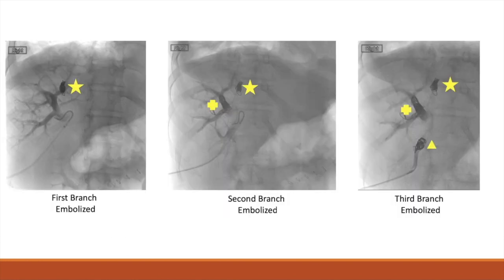After stasis is achieved and the pigtail catheter has been used to perform a portal venogram, we swap it out for an appropriate catheter in order to embolize the accessed portal vein, which will be the final target branch. Since access was achieved through a vein that needs to be embolized, the catheter is withdrawn distally to the point of interest and embolization is performed. The triangle marks the final point of embolization as we pull out of the portal system.